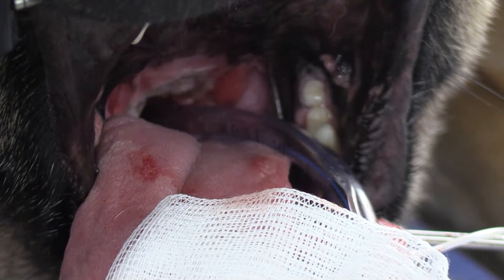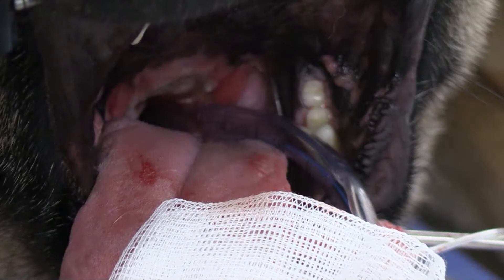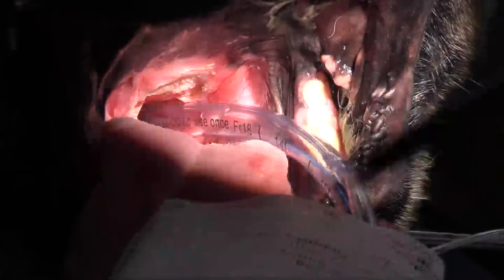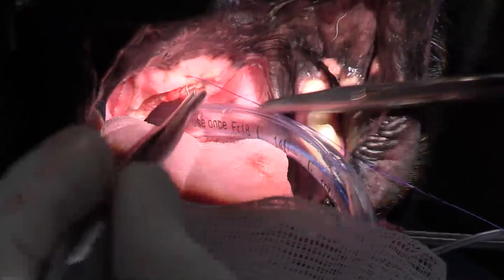Making absolutely sure that I'm closing my oropharyngeal mucosa to my nasopharyngeal mucosa up here. I'll put in a little simple interrupted suture at the apex just like that to make sure I'm centered properly.